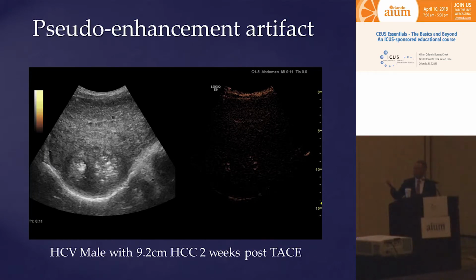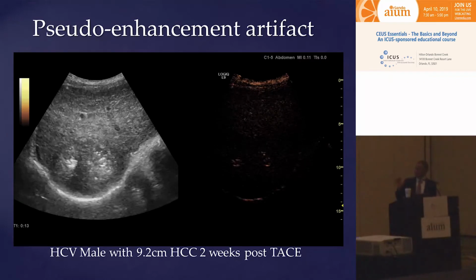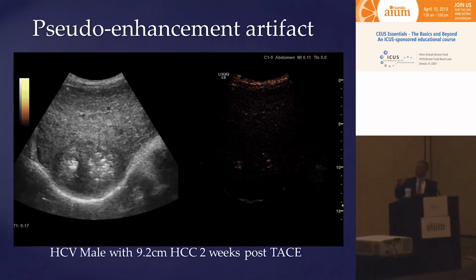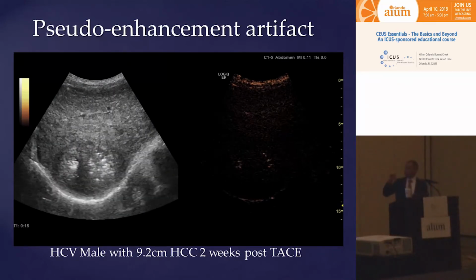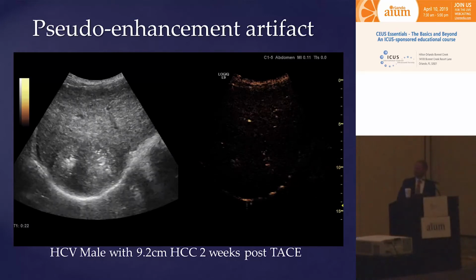Immediately after the TACE procedure, we deliver some gel sponge into the lesions, producing these very, very bright echogenic reflectors. So sometimes we have calcifications or something else depositing in those ablation cavities after procedures. And you can see some artificial enhancement in those cavities. The caveat is it happens late. And you see in the arterial phase, all those bright areas are pretty much devoid of contrast.